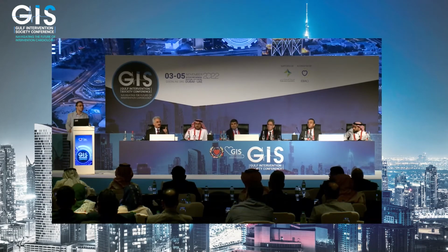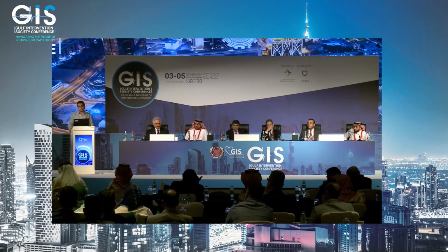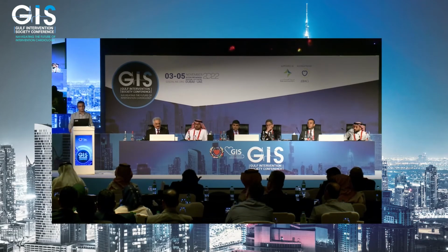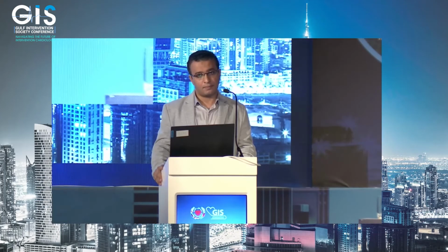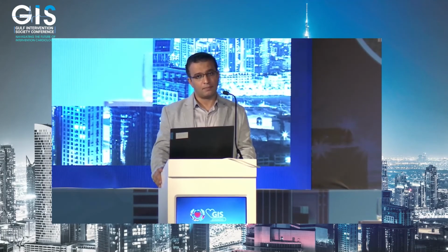Okay. Thanks very much. It's excellent management of the case. My advice to the one who is standing beside me, who is helping me, and to all of us: never put the inflator on the stent while it is not yet in place.